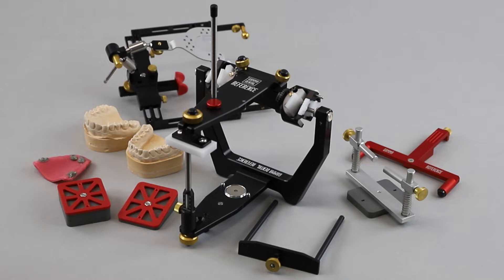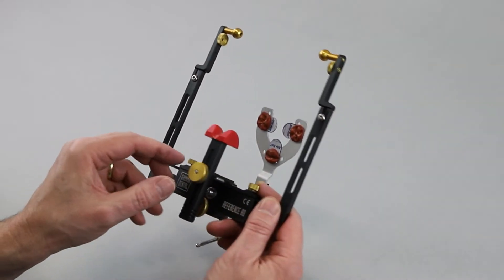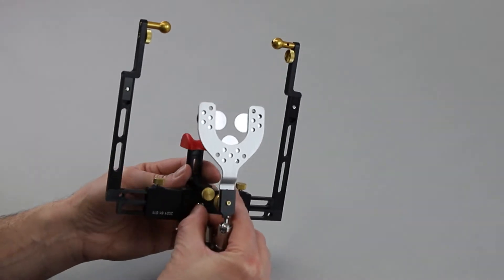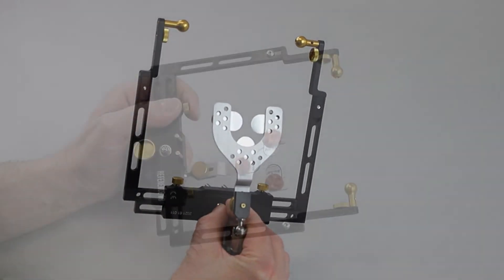After removing the face bow from the patient, dismount the nasion support and the porus supports, thus making the mounting plates accessible.